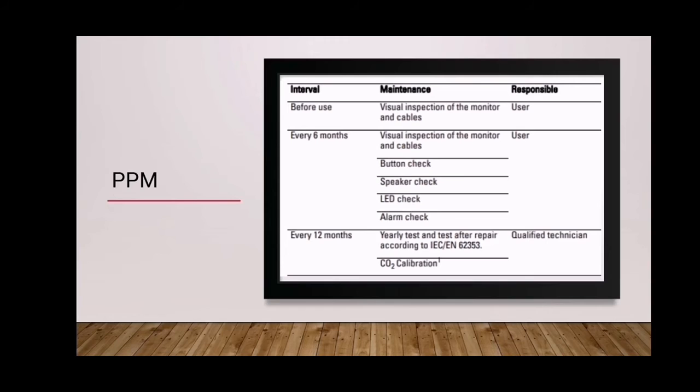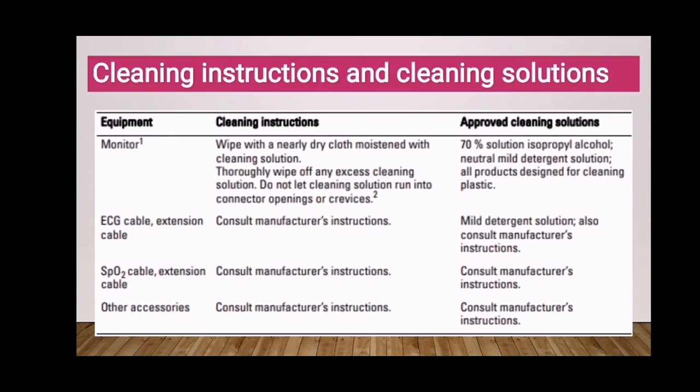PPM: you need to check before use, every 6 months and every 12 months. Cleaning this equipment, and last is troubleshooting.